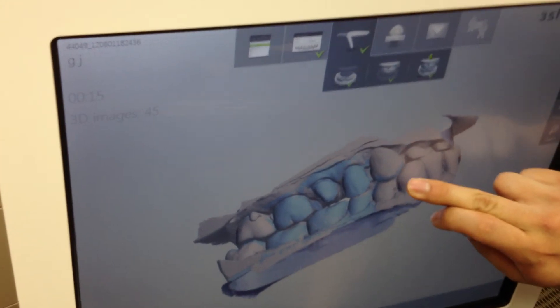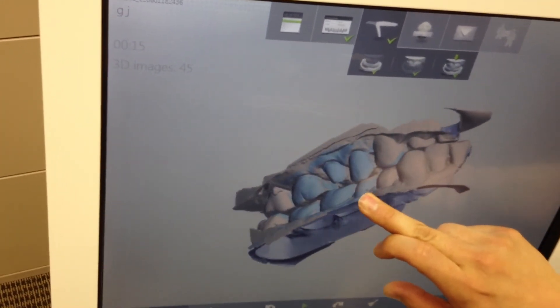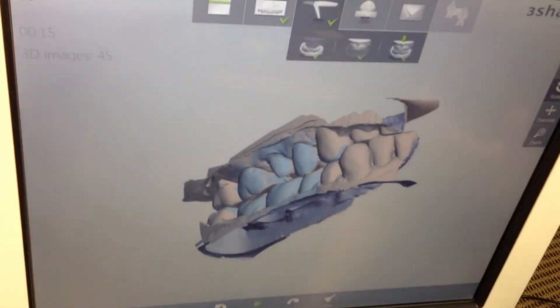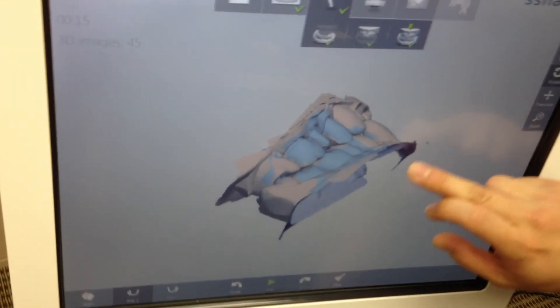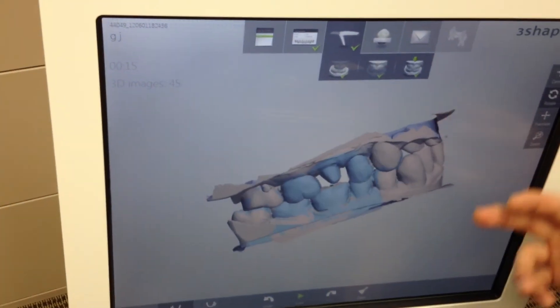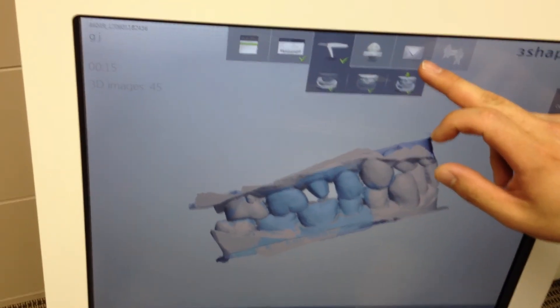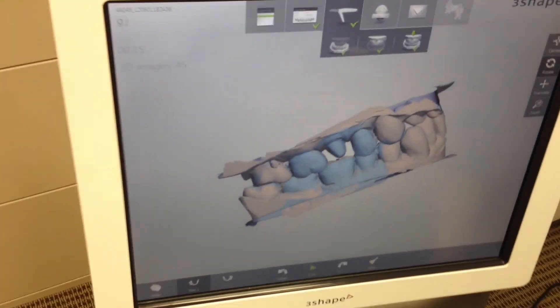Over here is my full model. What's nice about this is you can actually check your bite on here. Unlike conventional impressions, it's hard for them to check if the bite is actually correct — but over here they can check that. So you just take this file, hit this send button right over here, and it gets sent to the lab automatically.